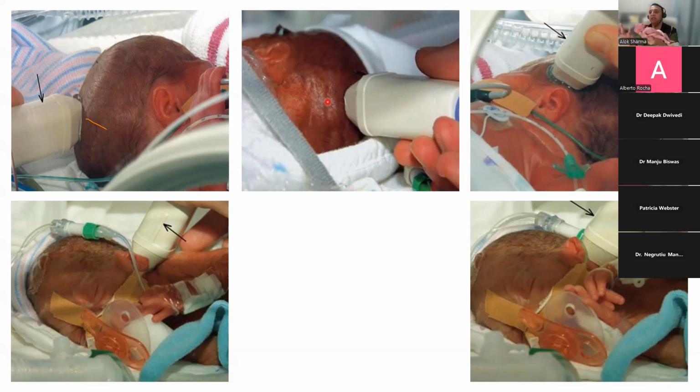When I am holding the baby and trying to do the scan, I'm also looking at the screen, I'm image optimizing, and I'm using my left hand if I'm a right-handed person. If the baby moves, I can't keep up. But if I've got my fingers on the baby's fontanelle, the way I've learned is I can tell I'm in the right place by the contact I have with the probe, the baby's head and the fontanelle, along with my screen. Learning that hand-eye coordination is absolutely crucial to getting good images. So it's not just about the probe you use, it's also about the comfort in which you perform the scan, the comfort of the baby, and at the end of the day, it's really important for you to have good hand-eye coordination.